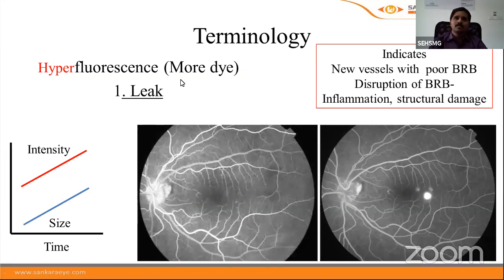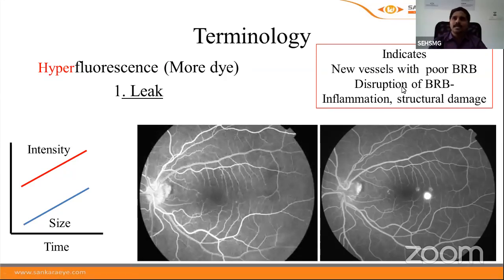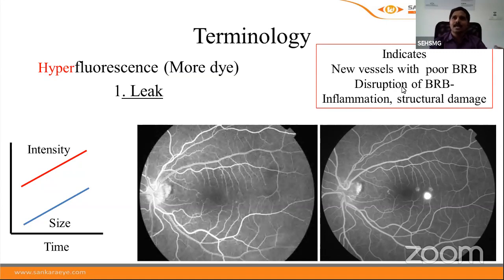Leak is characterized by an increase in both intensity and size of hyperfluorescence over time. We see an area of hyperfluorescence that is tiny initially, but as time progresses, both the size and intensity increase. This indicates either a new vessel with poor blood-retinal barrier allowing dye to extravasate into tissue, or a disruption of the blood-retinal barrier due to inflammation or structural damage. The fluorescent dye is normally localized to retinal and choroidal vessels and doesn't leak into tissue except at the choriocapillaries.